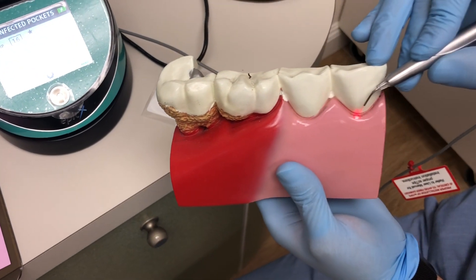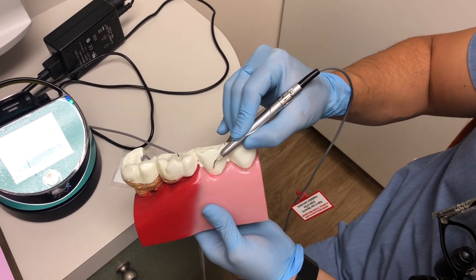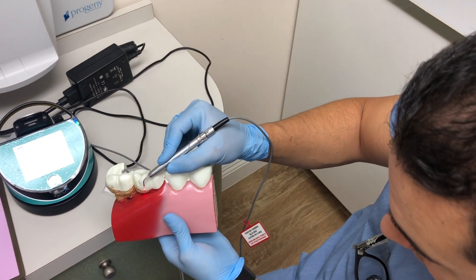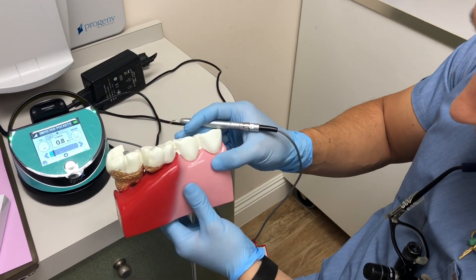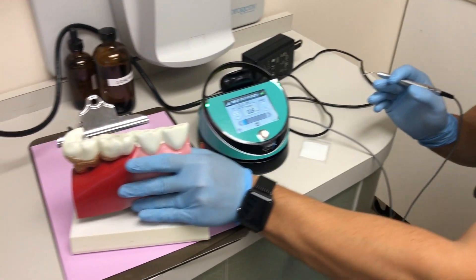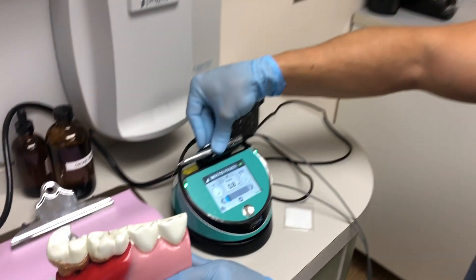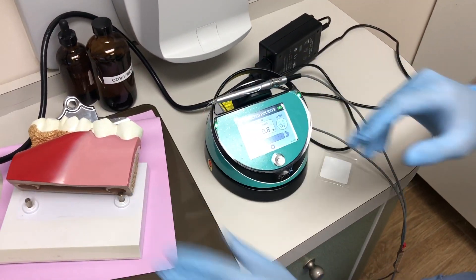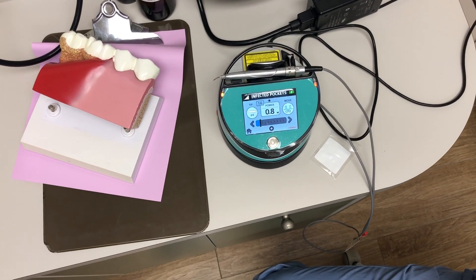I'm going to pretend I'm finishing up the last quadrant of the patient's mouth. I've gone on both the buccal and lingual of every tooth surface, and I am now done with the laser decontamination part of the treatment and ready to go to hand instrumentation. Place the laser back in the holder and press the button to turn it off. It is now off.